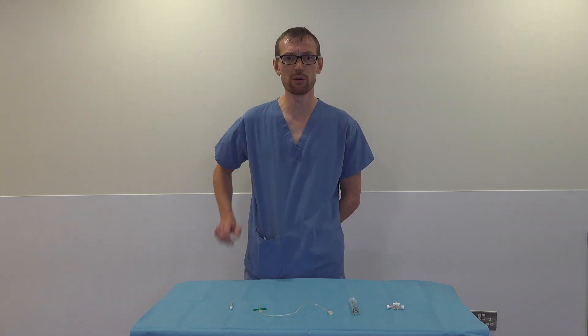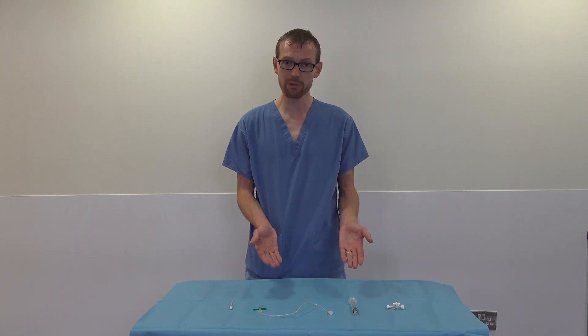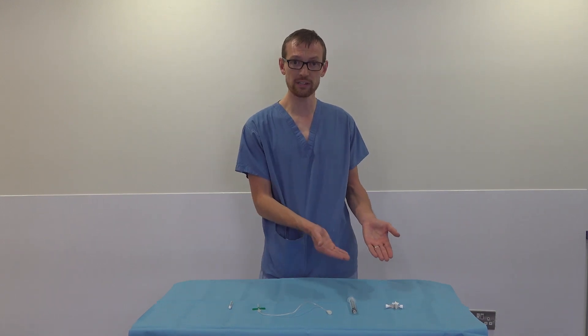We're going to demonstrate needle decompression today. It's very important to know how to set it up and to know where to insert it in the baby. You will see an improvement very fast in your baby once you have performed this procedure. As you can see, we only need four pieces of equipment.